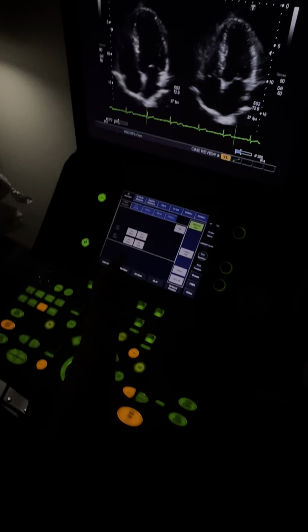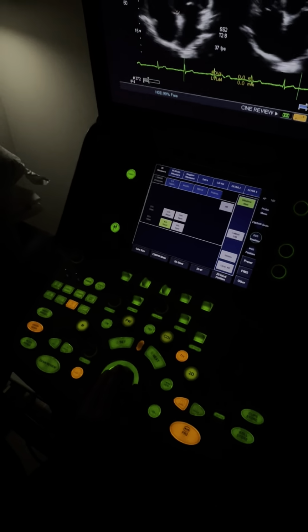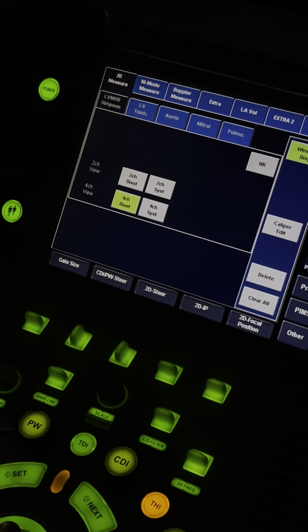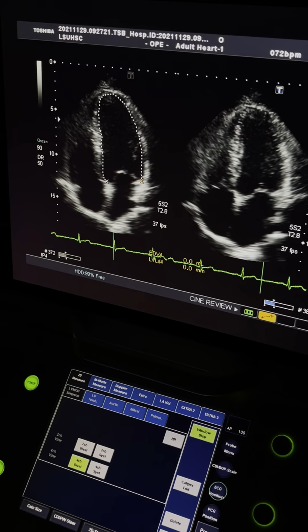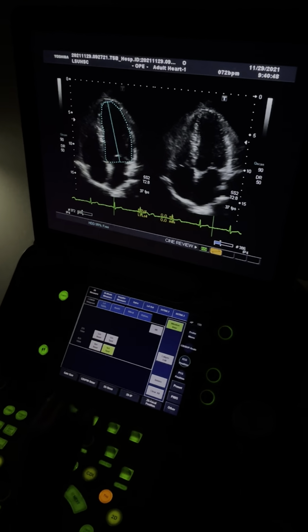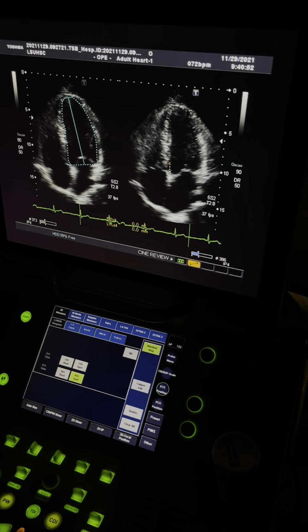Go to Simpson's, 4-chamber diastole. Start at the apex. With your best Etch-a-Sketch skills. I will tell you, the newer machines have auto packages that are very nice, but you still have to be able to correct them when they have a mind of their own. Then I went to systole.